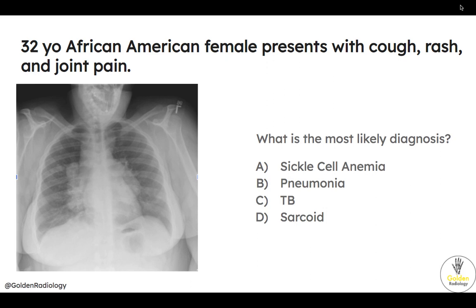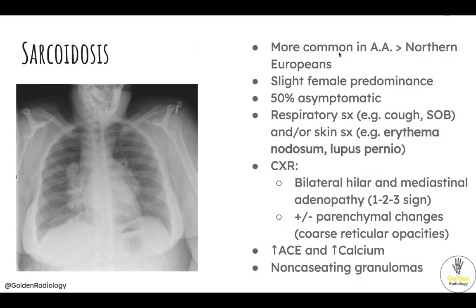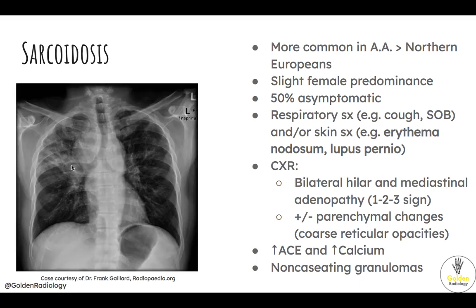Next question: 32-year-old African-American female presents with cough, rash, and joint pain. What is the most likely diagnosis? This is sarcoid. The tip-off is lymphadenopathy in the mediastinum to the right of the trachea, as well as the bilateral hila — this is known as the 1-2-3 sign, a classic appearance for sarcoidosis. Sarcoid is most common in African-Americans with a slight female predominance. Labs may show elevated ACE and calcium levels, and pathology will show non-caseating granulomas. About half of patients are asymptomatic; the rest have respiratory symptoms such as cough and shortness of breath, and skin symptoms such as erythema nodosum or lupus pernio.